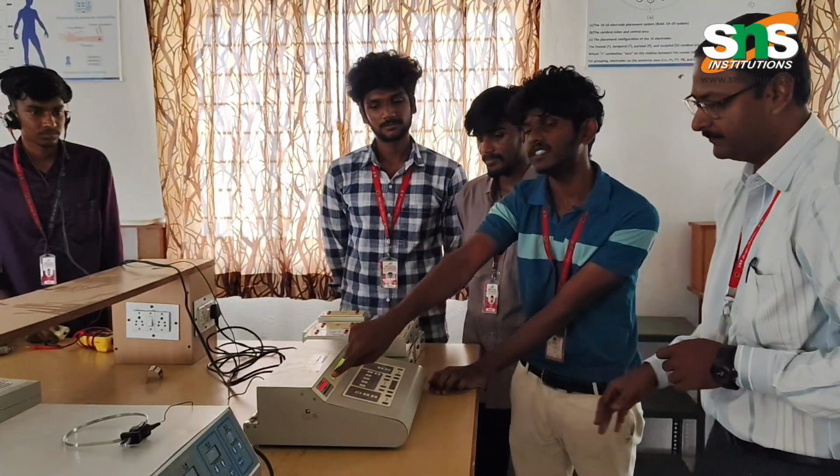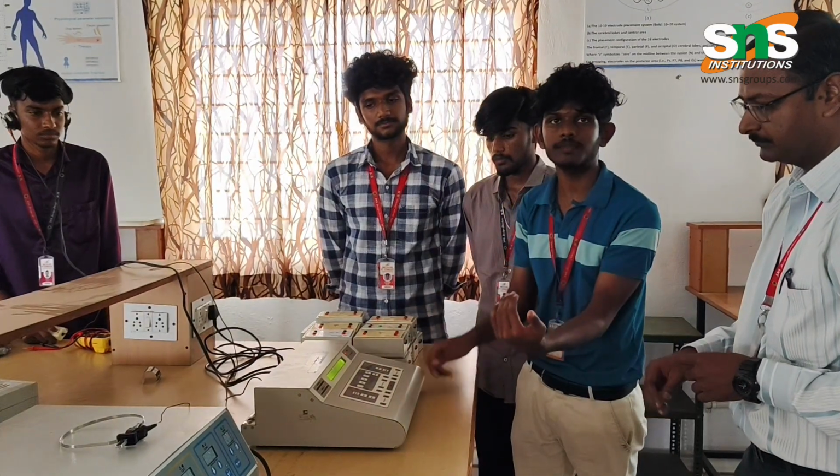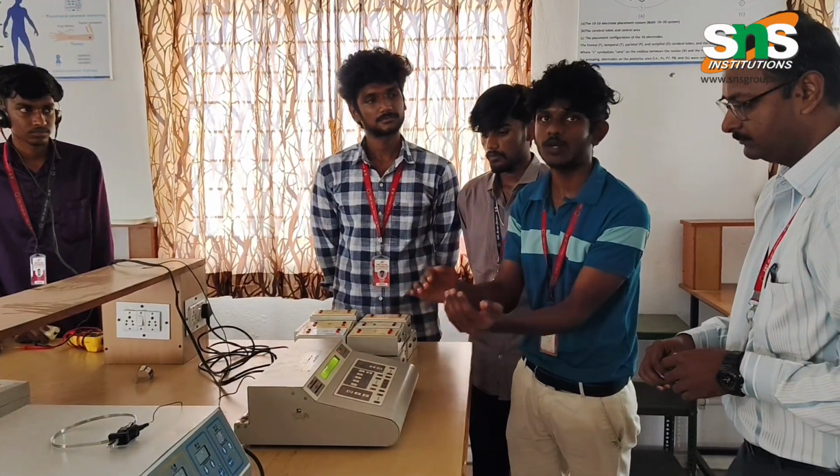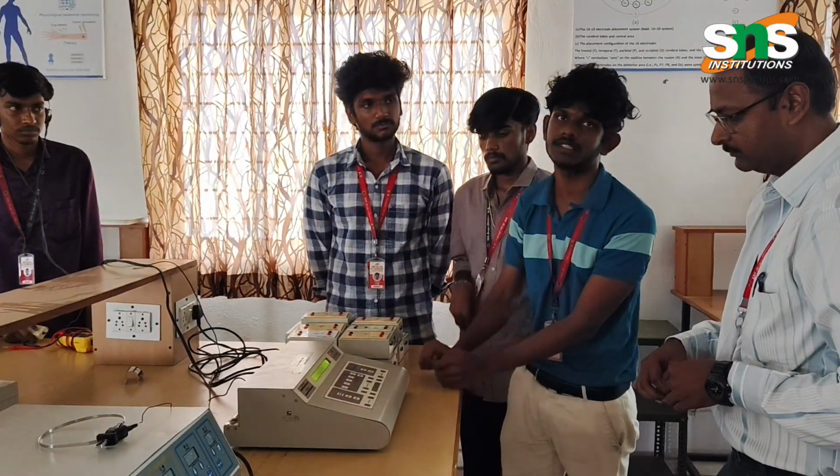You can see here the patient gave the response since we increased the decibel, from 40 decibel to 45, and now 50. So the basic hearing of the patient starts from 50 decibel. We can come to a conclusion from this.